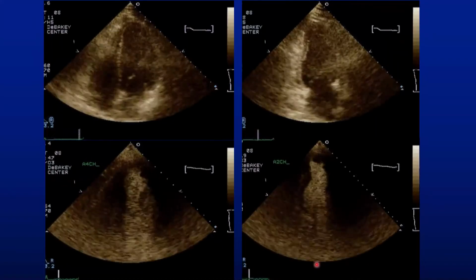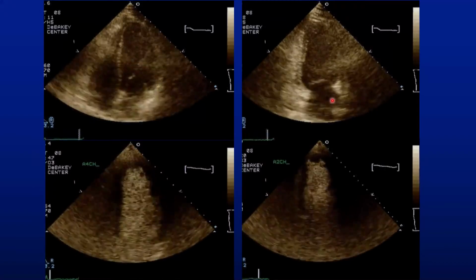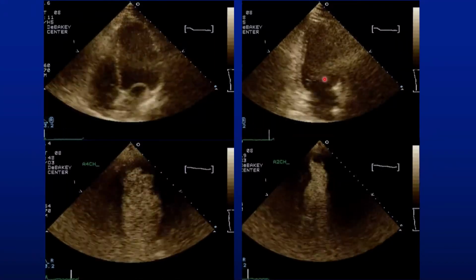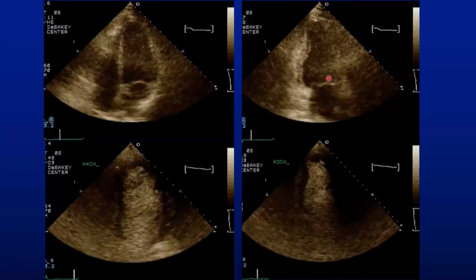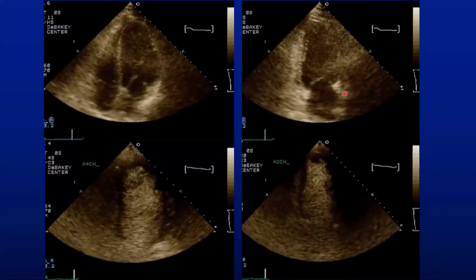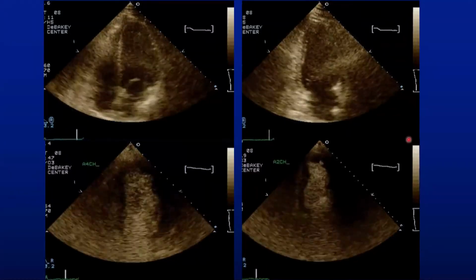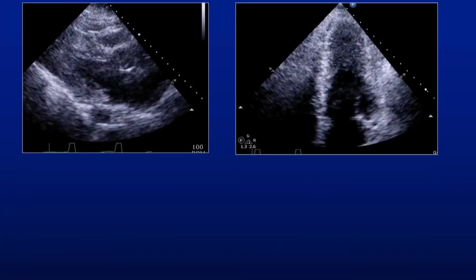Isn't that interesting? There's a clot, and actually, in retrospect, using the retrospectoscope, take a look. You could see something there, but I have no idea whether this is real, yes or no. Has changed quite a bit. All right. Let's take a look at this case.